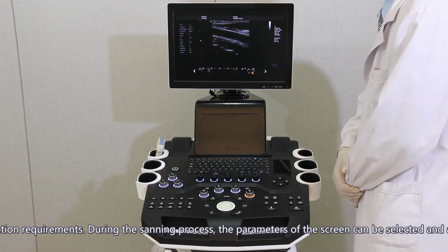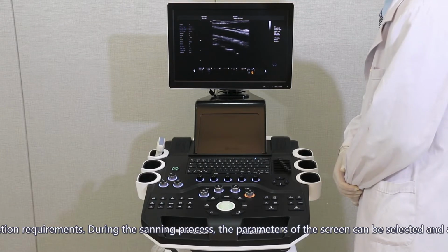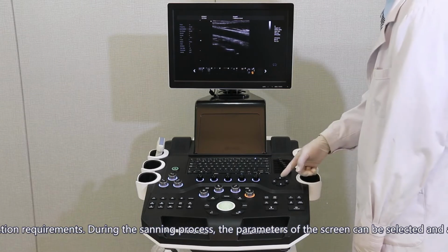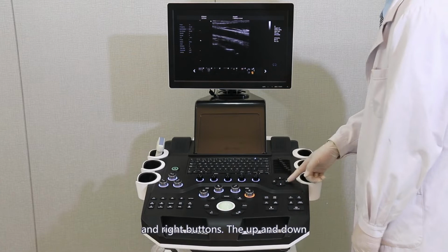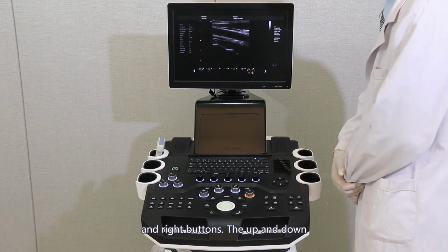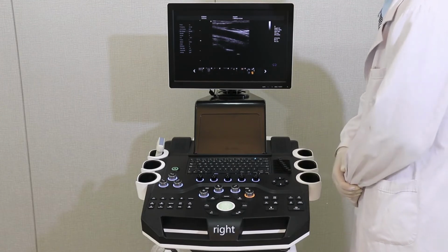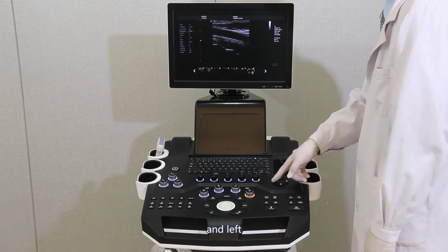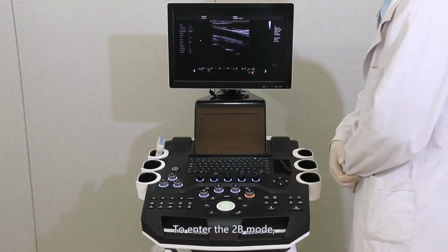During the scanning process, the parameters on the screen can be selected and adjusted by the up, down, left, and right buttons. The up and down are for selecting. Right and left are used to adjust the parameters.